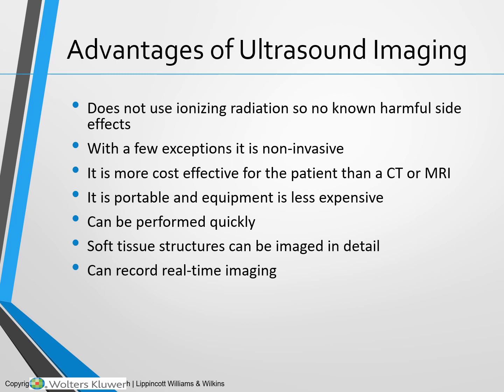It is more cost-effective for the patient than a CT or an MRI. Ultrasound is significantly less cost than those type of imaging studies. It is a portable scan and the equipment is less expensive. So we can take our ultrasound machine and we can travel to the bedside, and the equipment is less in general to purchase. Ultrasounds, for the most part, can be performed relatively quickly.